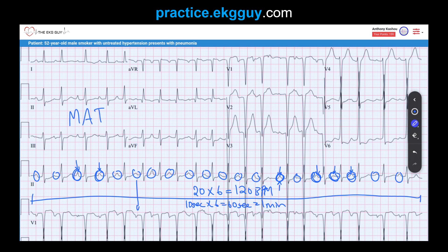Each P-wave morphology originates from a different ectopic atrial focus. The first tip: varying P-wave morphologies in multifocal atrial tachycardia suggest the absence of one dominant atrial pacemaker. This differentiates it from sinus tachycardia with frequent multifocal premature atrial complexes, where you see a dominant sinus pacemaker with the same morphology interspersed with different premature atrial complexes.